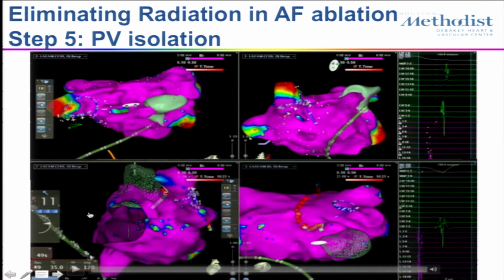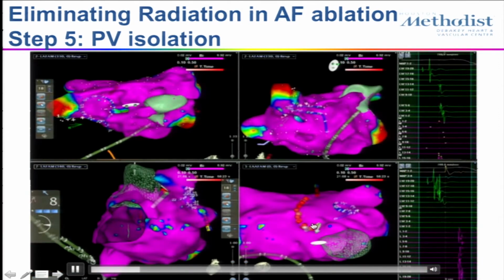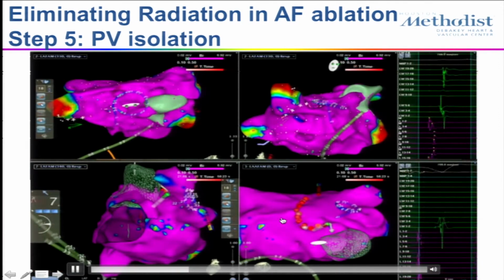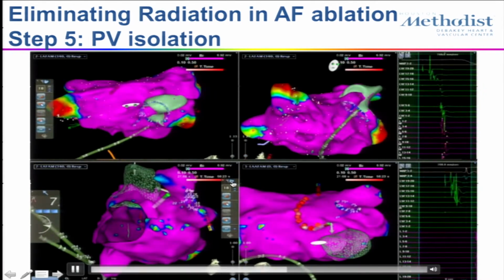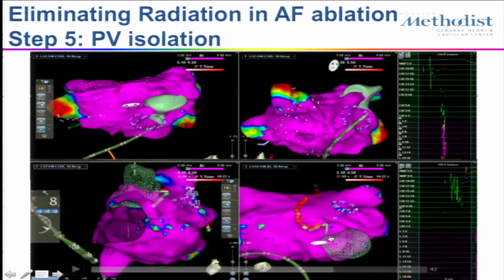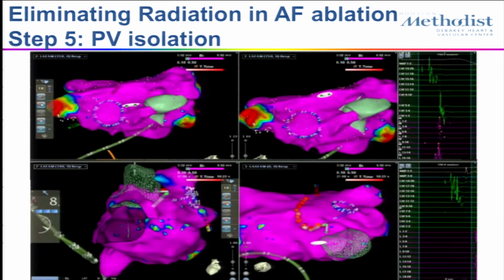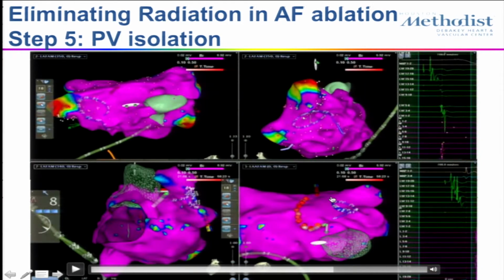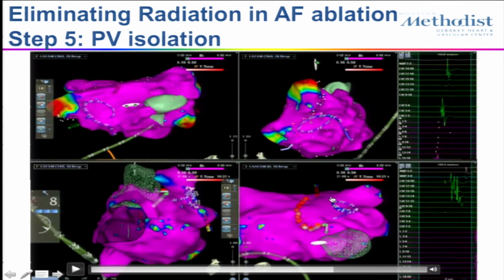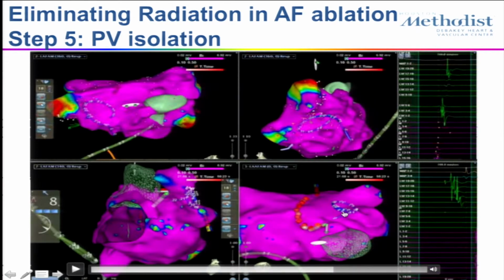So anyway, I've completed the geometry of the left atrium, and now you see here I have the ablation catheter. I'm burning in that left atrial ridge, which is really hard to know that I'm for sure in that muscle making contact. Now, another piece of information, you see this arrow? This arrow indicates where I'm making contact, in the direction of my contact, you see in this superior view. That's another thing, superior view. This view is impossible to obtain in X-ray. You cannot put the eye here and beam X-rays through the patient's head. There's no problem. I can use any views, however I want them, to see where I'm going.